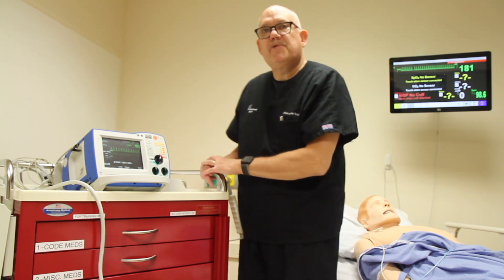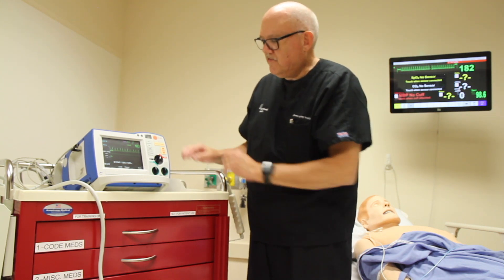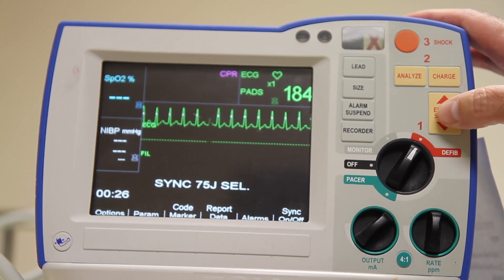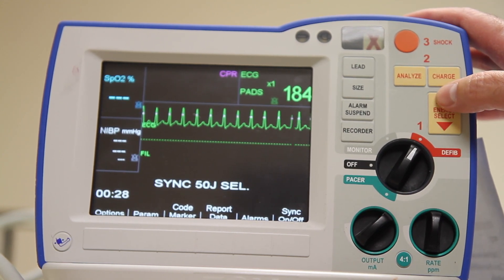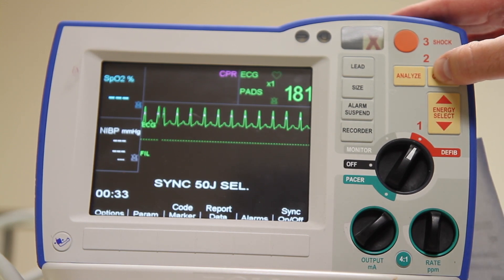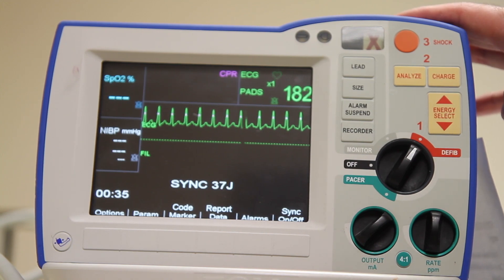Next step we're going to select an energy setting between 75 and 200 joules using the energy button here. Next, charge the device. When it is ready to fire we'll have a visual and audible indicator that it is ready.